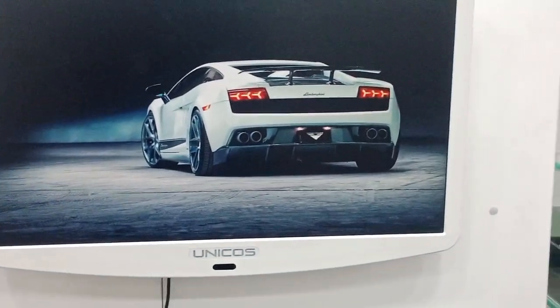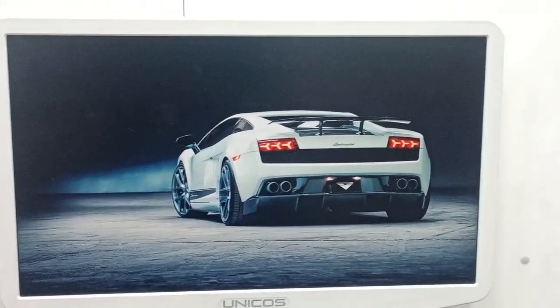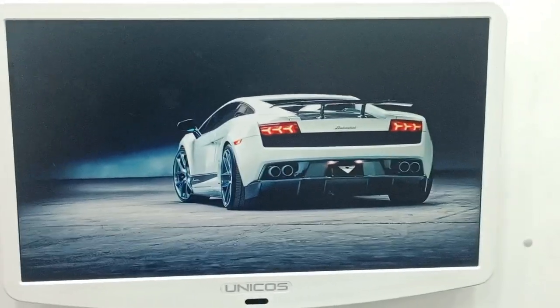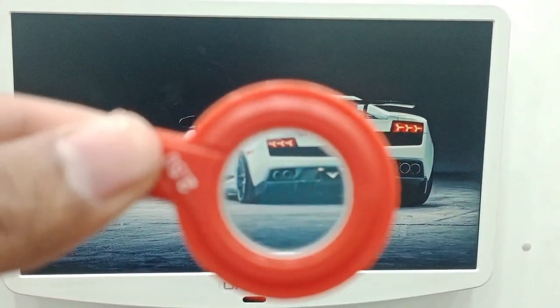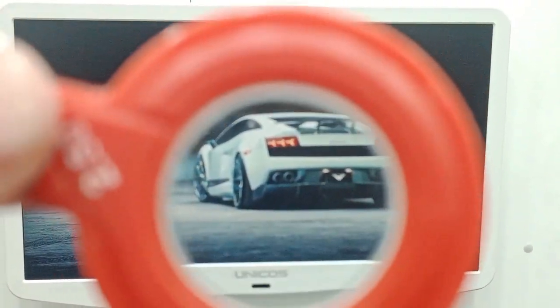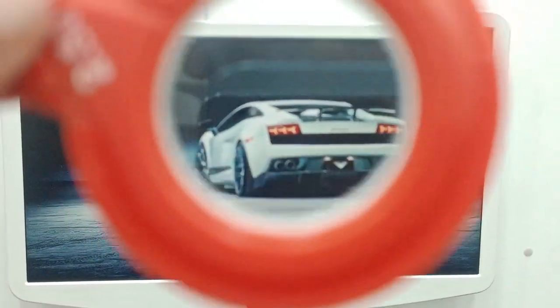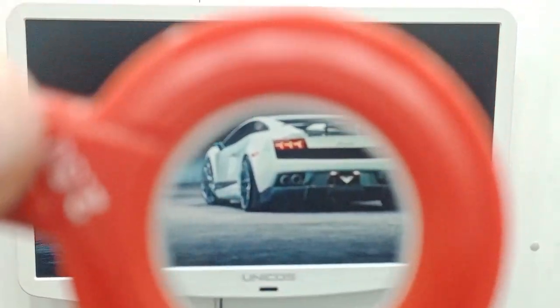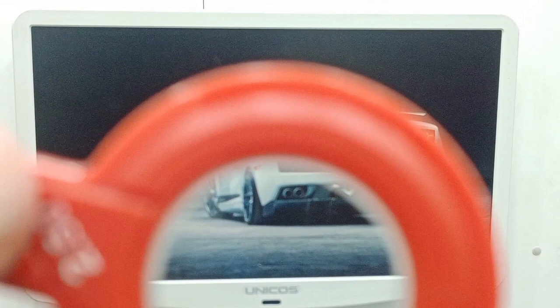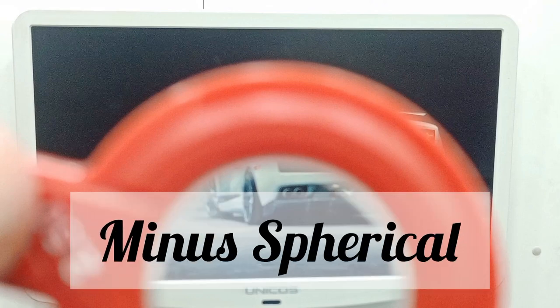Let's pick the minus spherical lens first and see what happens when I place it in front of my eye. As I move the lens upward, the car moves upward, and as I move the lens downward, the car moves downward. The object moves with the lens — in the same direction. Remember: if the object and lens move in the same direction, that is "with movement," and the lens is minus spherical.